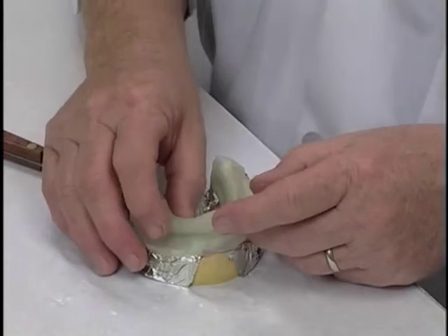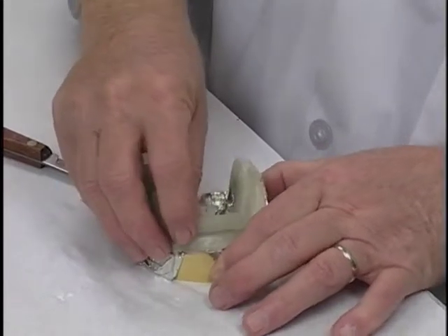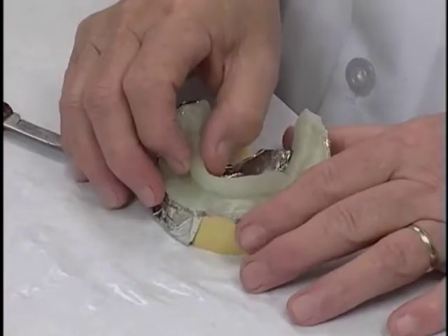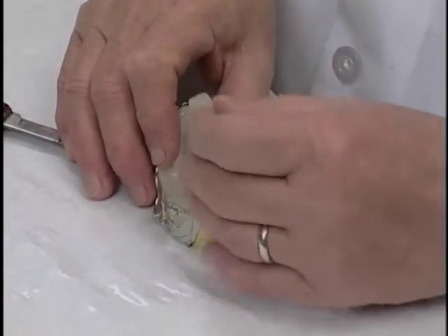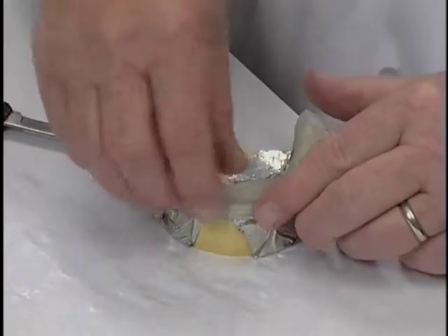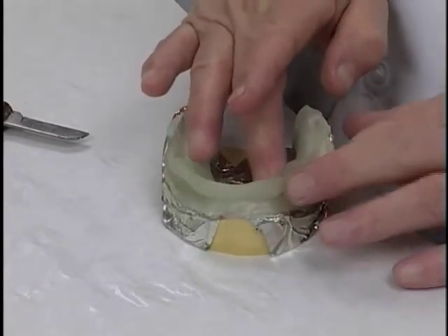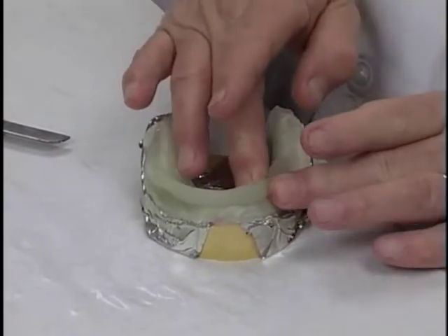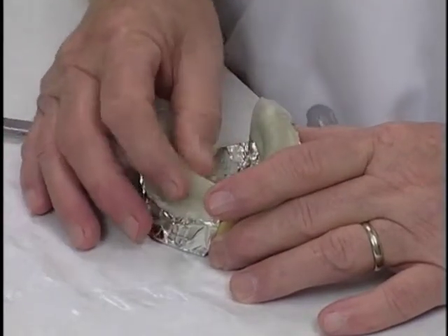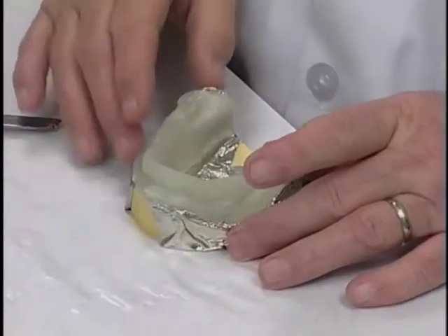And that handle now should be on the mandibular one posteriorly directly over the crest of the ridge. Anteriorly it can be a little bit labial to the crest of the ridge, but certainly not much. Now I've got that a little bit too far around to one side, so I need to go back with this now, and we'll start at the midline with it. It can be a little labial to the crest of the ridge on the labial portions and the anterior portion, but posteriorly we want it over the crest of the ridge. We adapt it in very, very well so that it adheres to the original material.